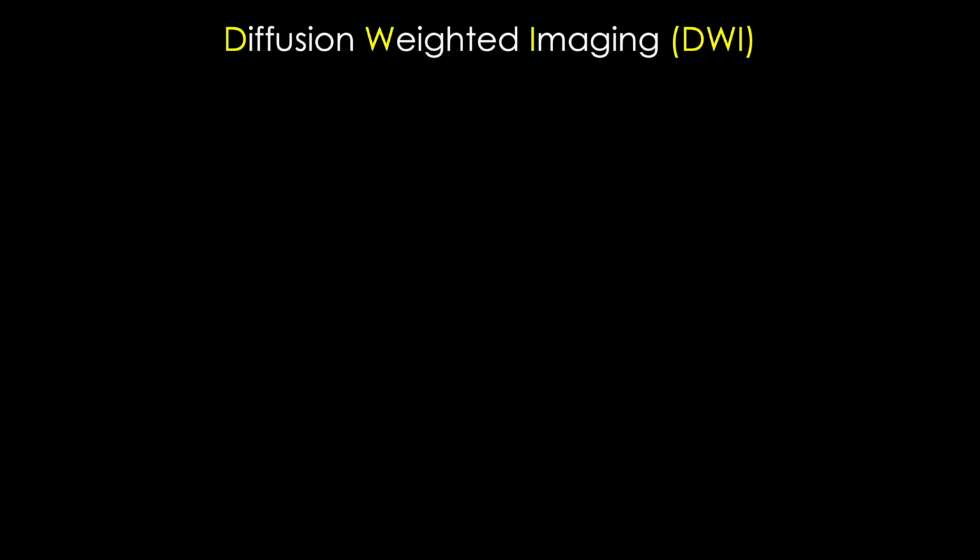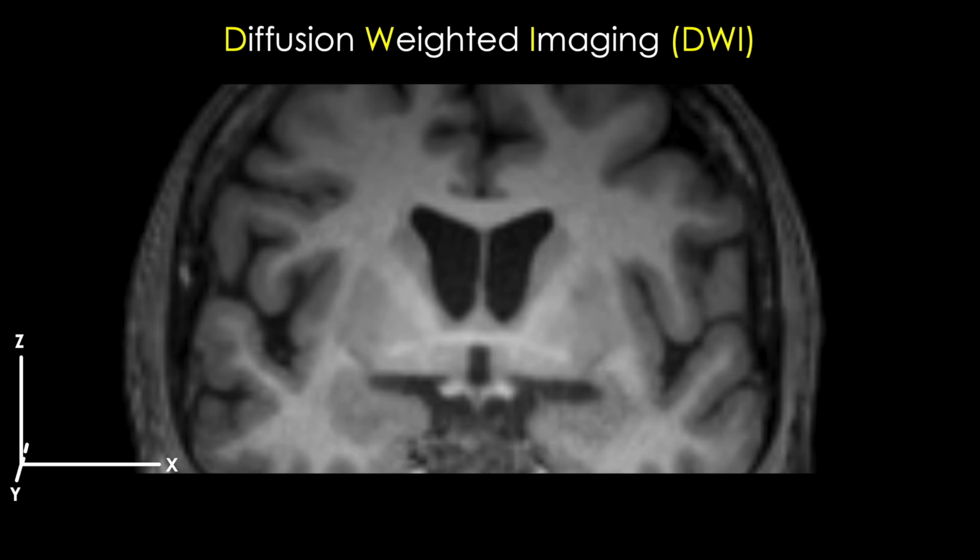Now let's go back to our experiment, except this time, imagine a drop of water here, within the corpus callosum. Now this region is special because it contains bundles of neurons communicating between the two cerebral hemispheres illustrated here. Do you think our drop of water is free to move about in all directions like the previous example?